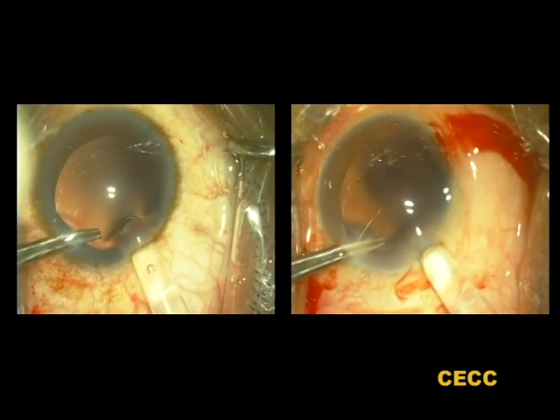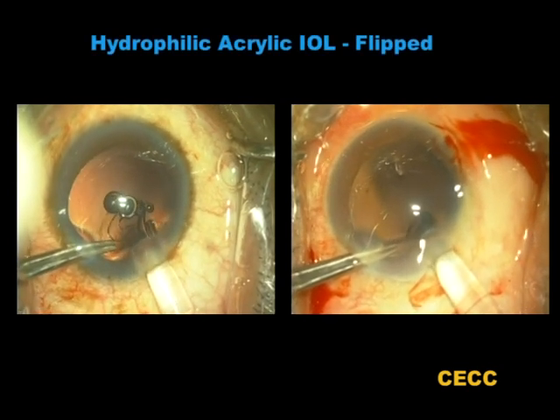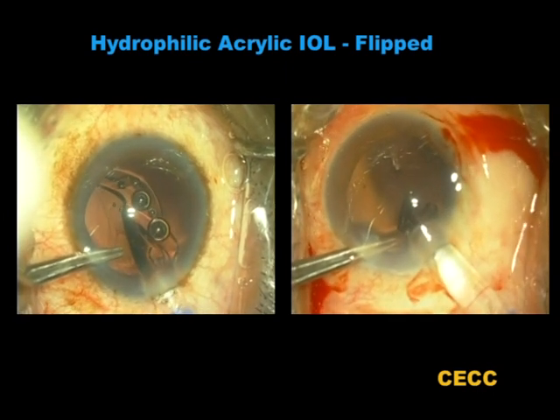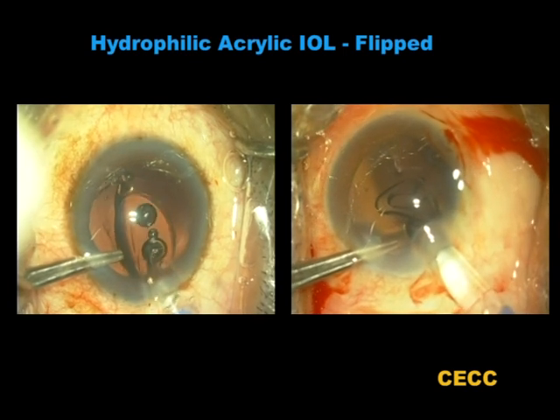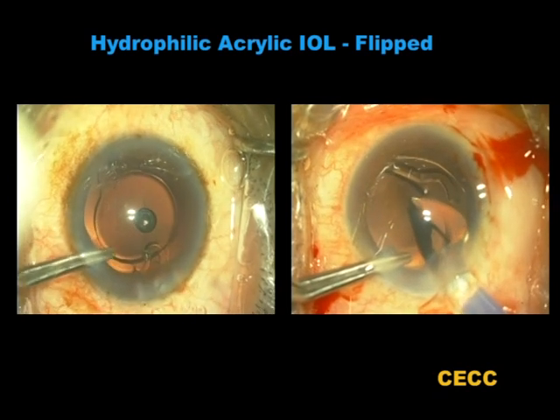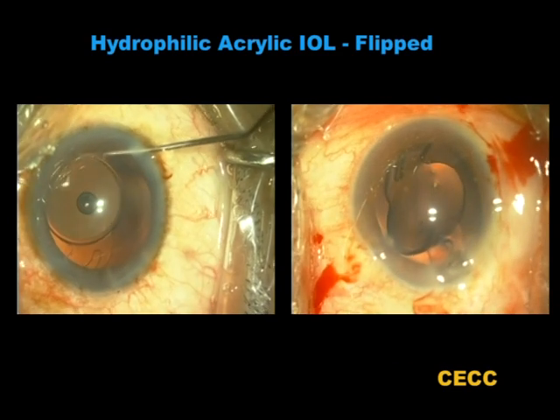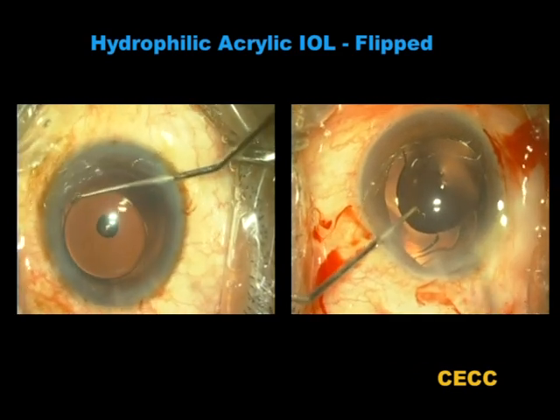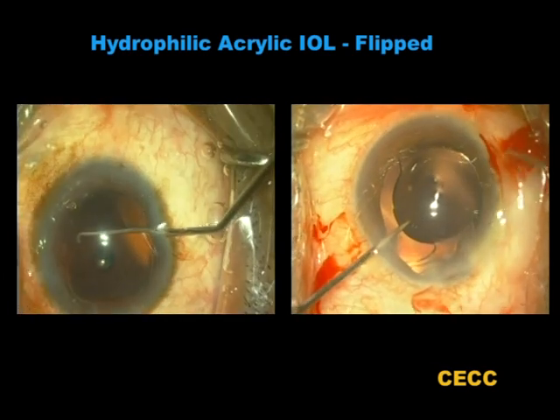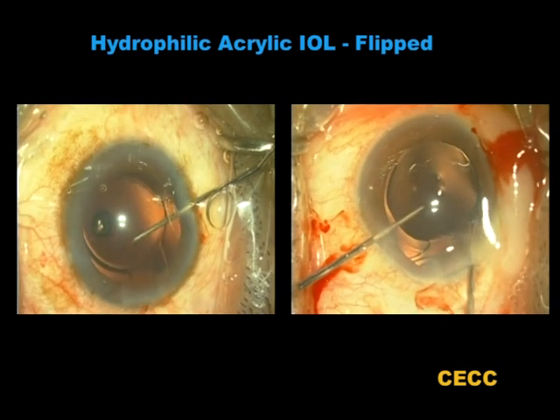These two patients were scheduled to receive single-piece in-the-bag hydrophobic acrylic intraocular lenses. All the steps went on as planned until the time of exit of the optic from the cartridge. For some reason, both lenses flipped at this stage and got oriented front surface back, which was not the intention. This lens being an equiconvex IOL without any angulation, one option would be to implant the lens in the bag as shown in the video to the left. Another option would be to flip it back to its intended orientation as shown in the video to the right.